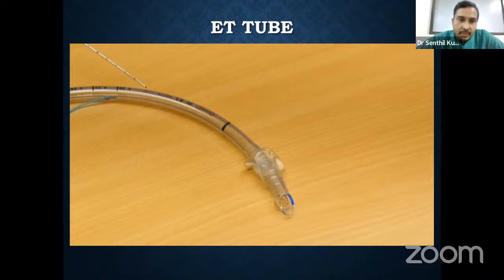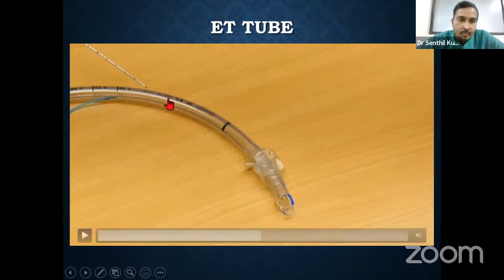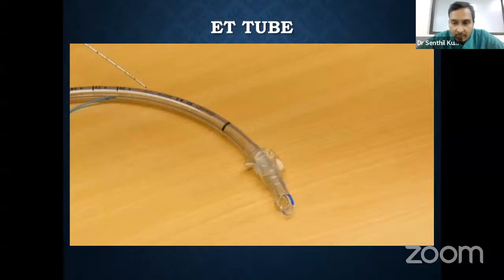Followed by this, there is a mark that is the manufacturer's name, and you can see a few markings, that is 19, 20, 21, 22. These are all markings in centimeters from the tip of the endotracheal tube. Why do we need this marking? When we intubate a patient, we are supposed to fix the tube at a particular level, because there are chances that the tube might move inside or accidental extubation may happen, especially in cases where there is a lot of movement of the patient, such as head and neck surgeries.